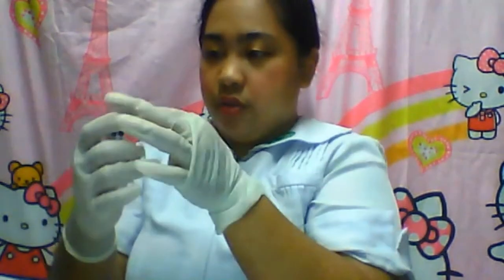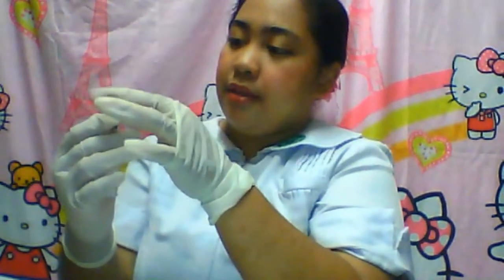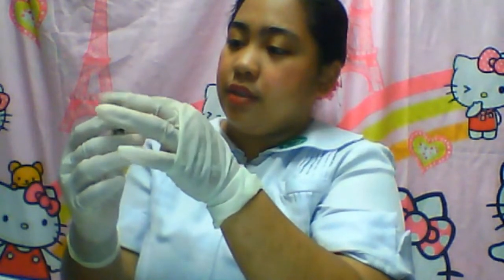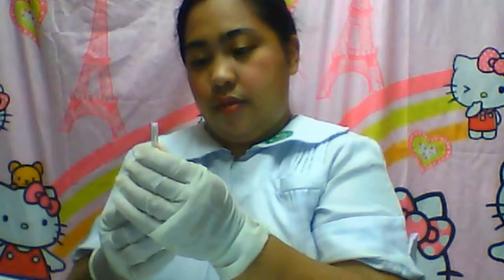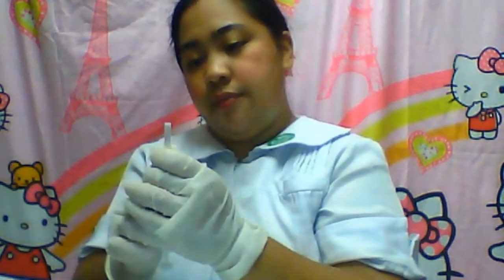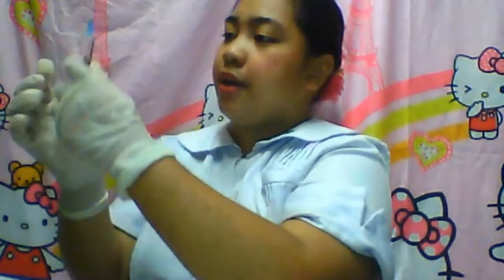If you see that there is still a bubble, what you can actually do is try to remove the bubble — just tap it until the bubble is removed. Great. And just to make sure, you can actually do this.